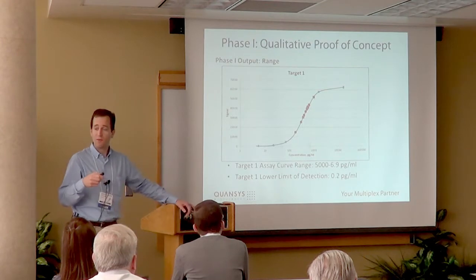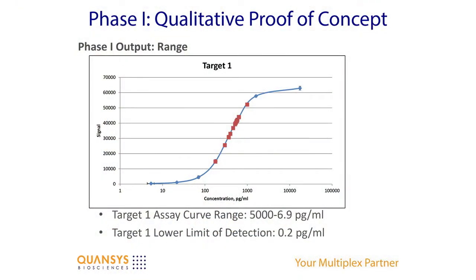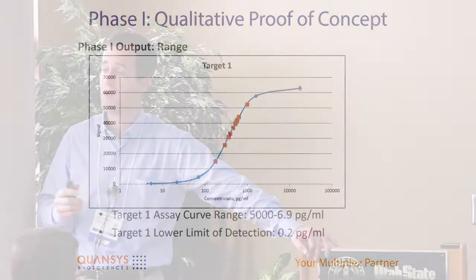Again, we had range requirements. They gave us some samples. These are serum samples they gave us. They wanted to ensure that the assays we developed were diagnostically relevant, meaning that their samples fell within the most linear portion of the curve that we may produce.